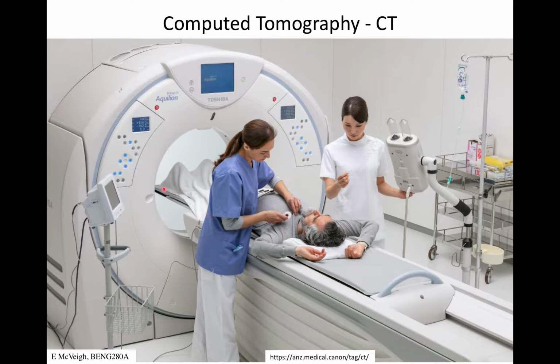That table can move with precision in this direction, the superior inferior direction, or the Z direction. And the precision of those motions is fairly high, sort of tenth of a millimeter or something like that. And nowadays these tables move quite fast.